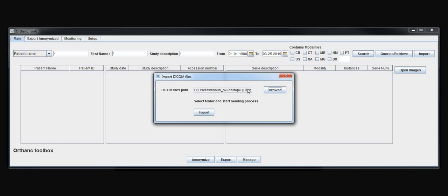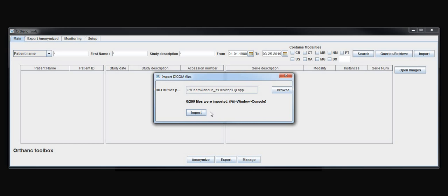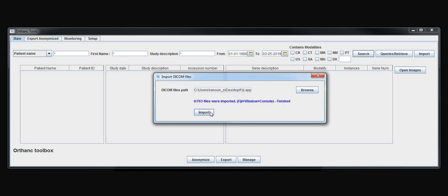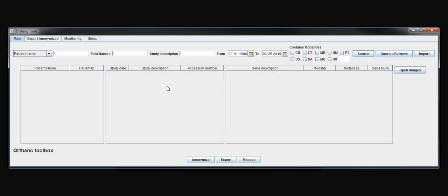I just put the path and press import and the software is going to recursively scan all files in this folder and import all DICOM files. So even if the folder is messy with non-DICOM files, it will ignore the non-DICOM files and push all DICOM files to Orthanc server and then you will be able to find the imported DICOM in Orthanc tools.